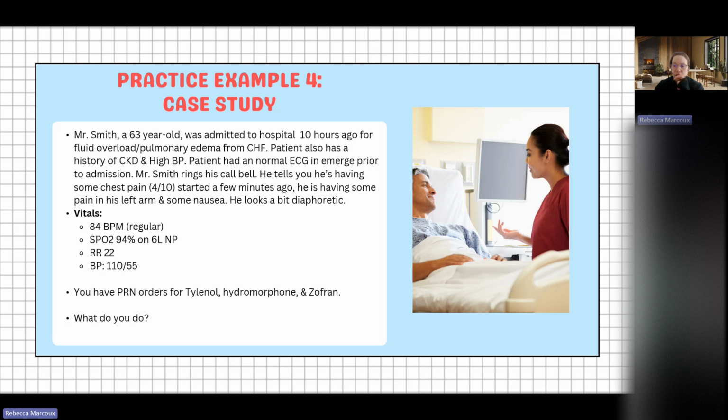ECG, redo the ECG, give antiemetics. Absolutely. So our priority for this patient is to redo an ECG. It was normal when he came into emerge, but he's having chest pain. We absolutely need to do an ECG.